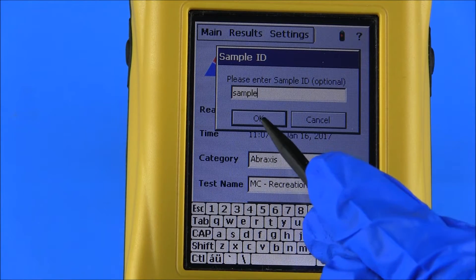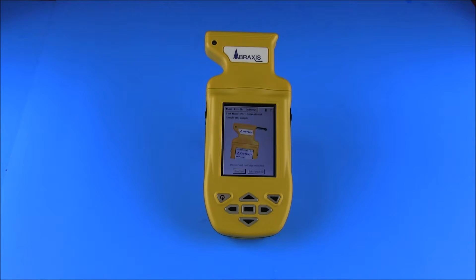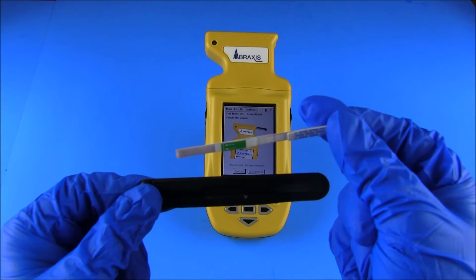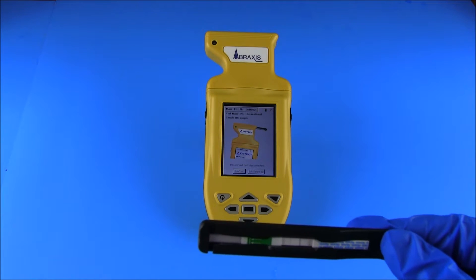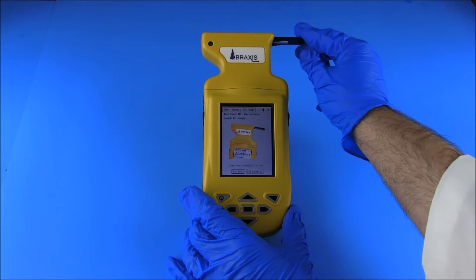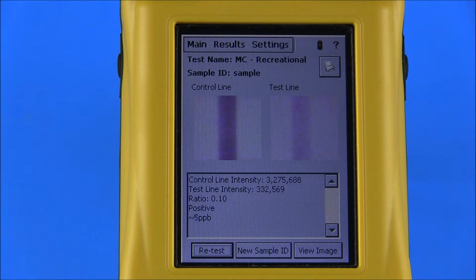The test name and, if entered, sample ID will then be displayed at the top of the screen. Insert the test strip into the black cartridge adapter with the sample pad end first. Be sure that the test strip remains flat against the adapter, the edges of the test strip will be under the guides, and that the strip is fully inserted into the cartridge adapter. With the test strip facing the user, hold the adapter by the raised thumb grip and insert the adapter into the reader until the cartridge stops and actuates the internal switch. After the strip is read, the results are displayed with the captured images of the control line and the test line.